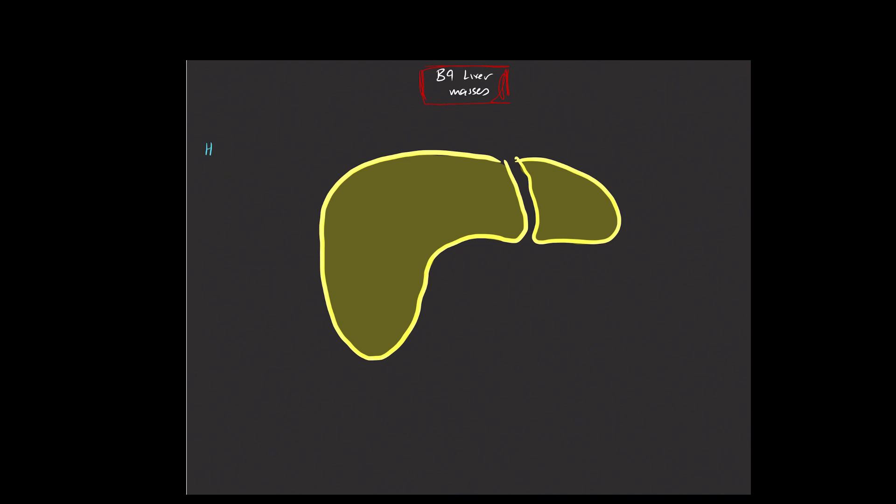The first lesion that I'm going to talk about is the liver hemangioma. These come in several varieties. The classic hemangioma is known as the cavernous hemangioma. You're going to think of cavernous hemangioma when you see a mass in the liver. On the T2-weighted images, the mass will be T2 hyperintense.